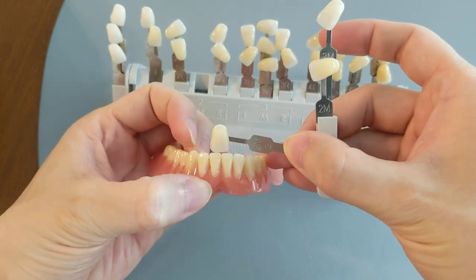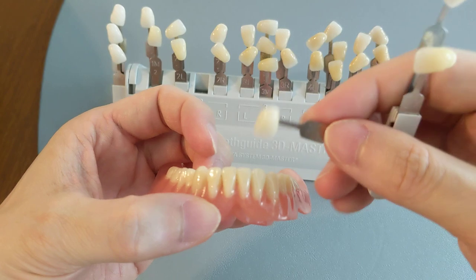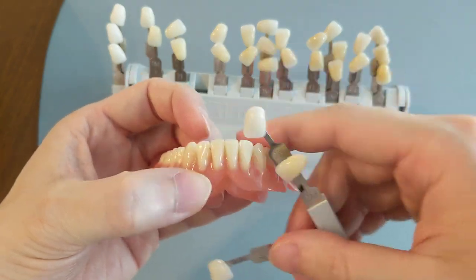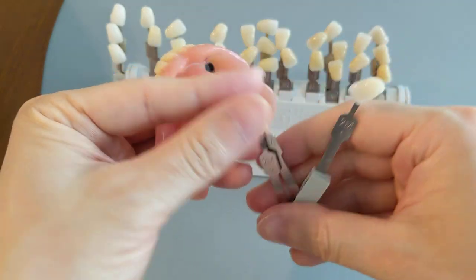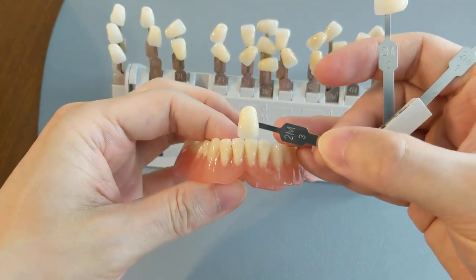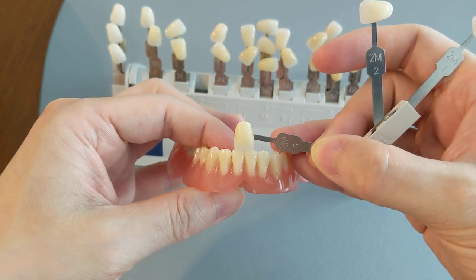It's pretty much like this color right here. This is a 2M2, and if we convert that, it would be like an A2. So this is pretty close to what the average is. The average color is actually the 2M3, which is still kind of close — maybe a little bit tad darker, but they're still fairly close.